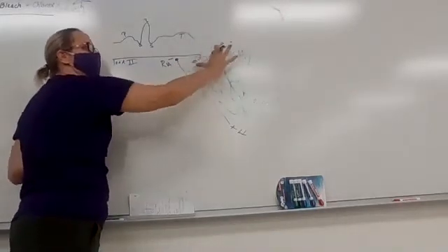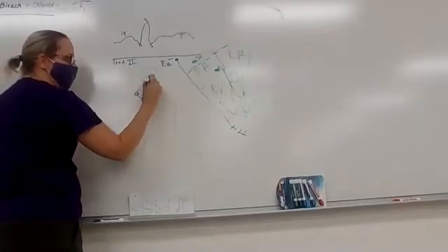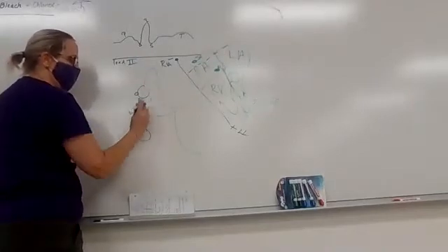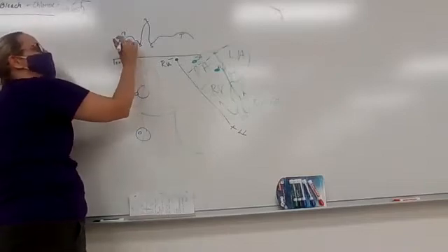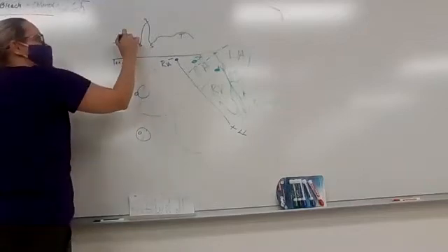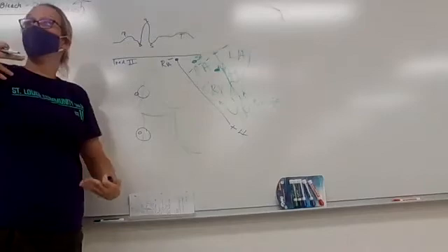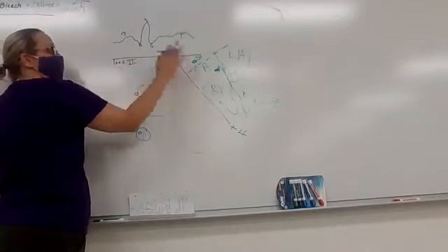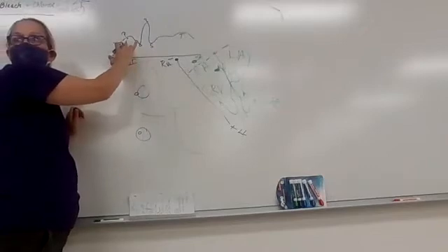We're going to capture all of those cells going through phase 0, the rapid influx of positive ions. And so we're going to see the depolarization of all of these cells start to show on the main measurement across the organ, that a bunch of cells in this region have started to rapidly depolarize, okay?